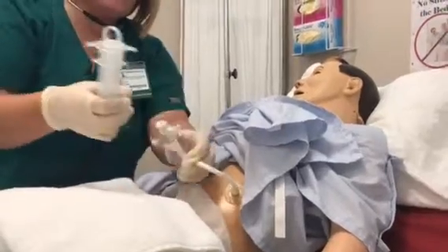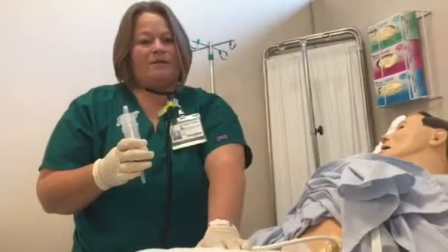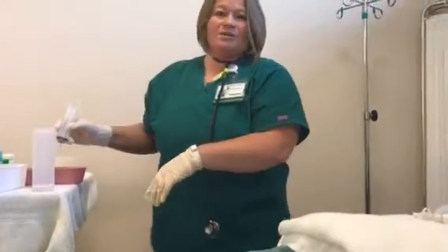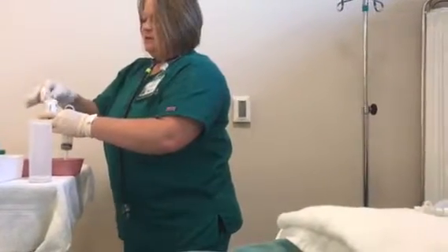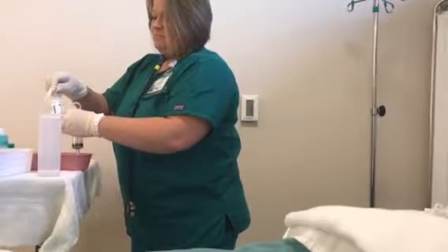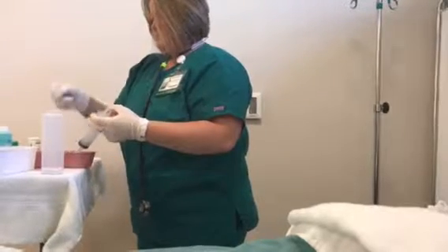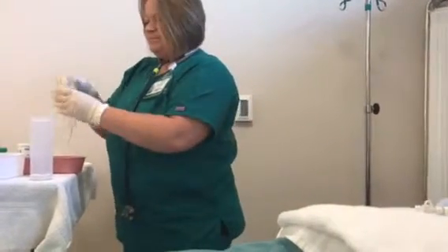You also want to make note that if you're doing an intermittent enteral feeding, you're going to want to check that before every feeding, and if it's continuous, you'd want to check that at least every 4 to 6 hours. So we're going to go ahead and check the pH of our residual. And the pH looks good, so we can go ahead and start our feed.